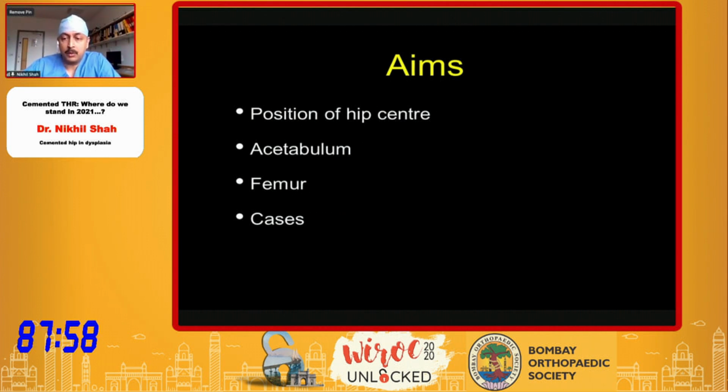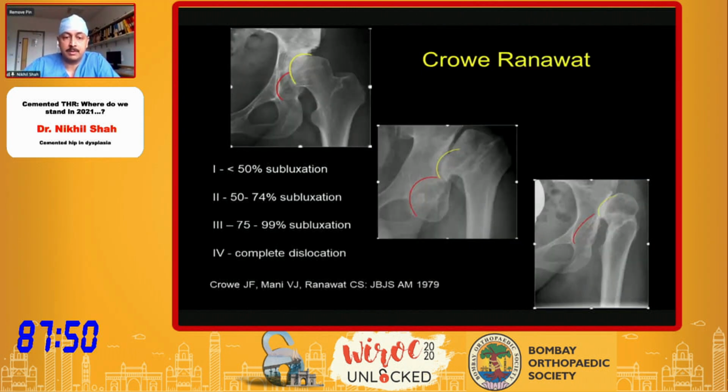dysplastic hip. Where am I going to put the hip center? How am I going to handle the acetabulum? What am I going to do to the femur? And then we will try and see this with some cases.